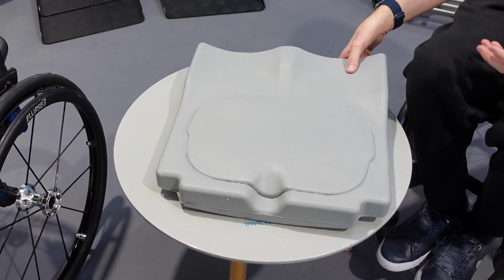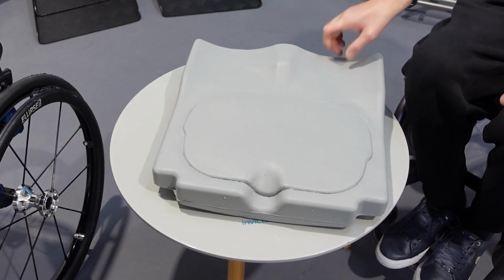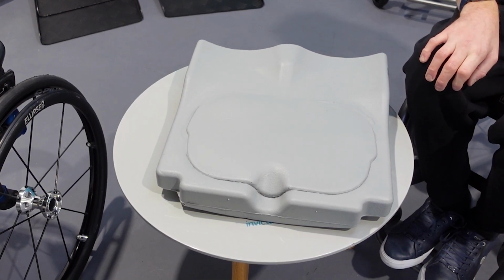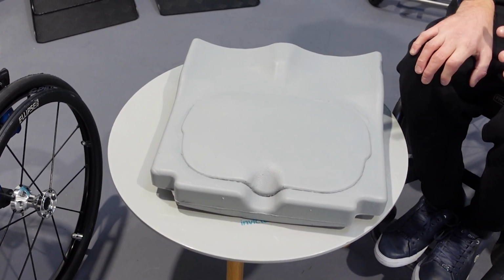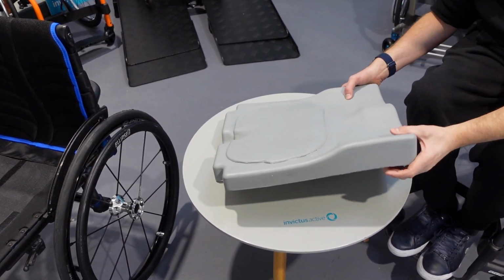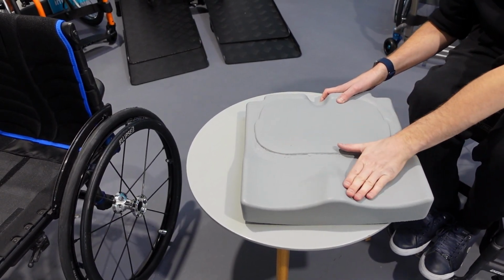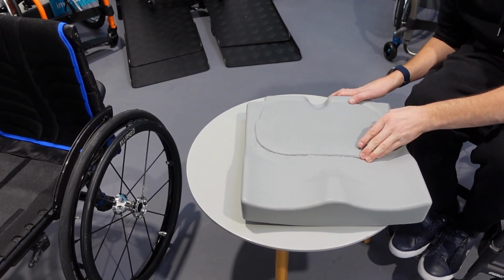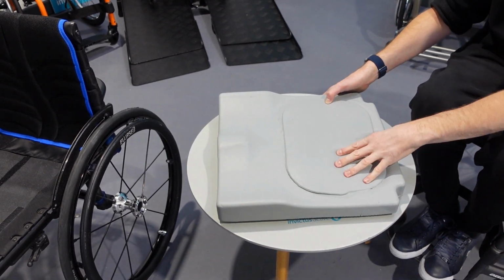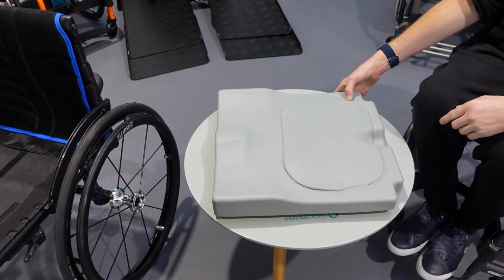If you've experienced pressure sores in the past and you have an ongoing issue, then maybe the JAY Easy Visco is not the best. You might want to go for a higher grade cushion. But from a standard cushion, it is certainly better than some foam and worth considering. So really the main features are, as I say, the contour there for your legs, and this area here, it's not separate, it's all part of the same cushion, but it is definitely a softer material than around the edge.